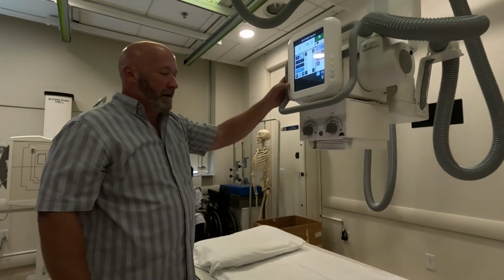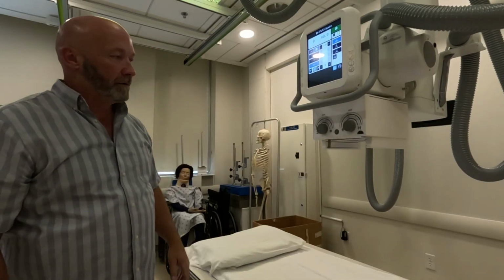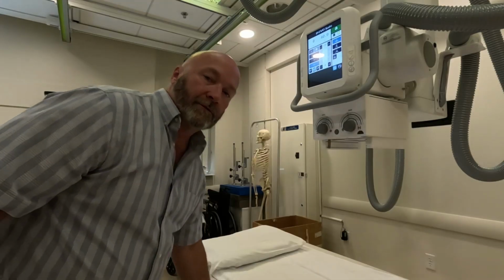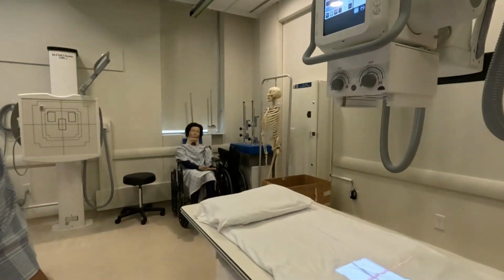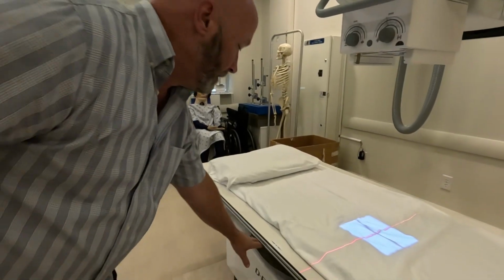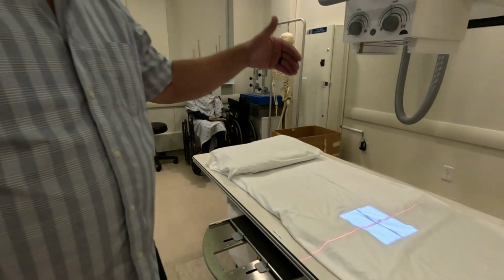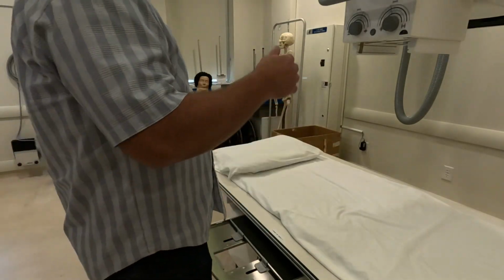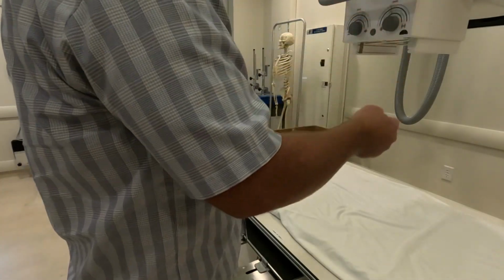And that is that, let's say we line our tube up to there. Okay, so we lock it in and it's pointing straight down to there. Our image receptor in this case is off by a little bit. So our image receptor is here. So after locking into the table, what you want to do is align to the image receptor. And whether you move the image receptor or you move the X-ray tube, it really doesn't matter.